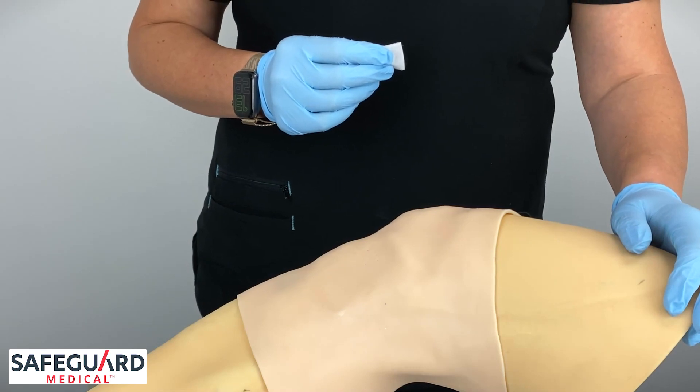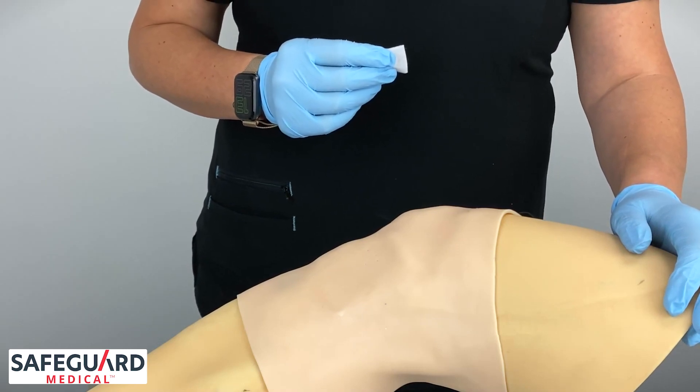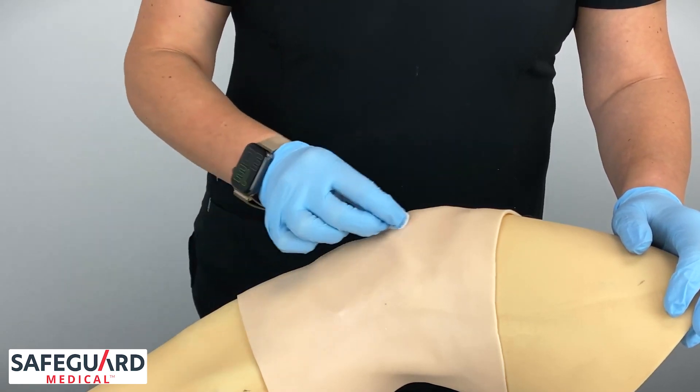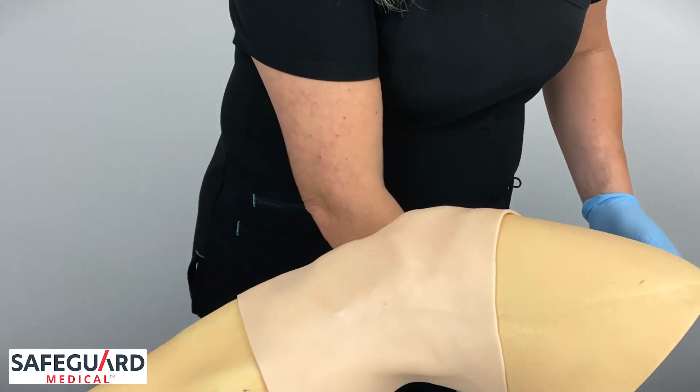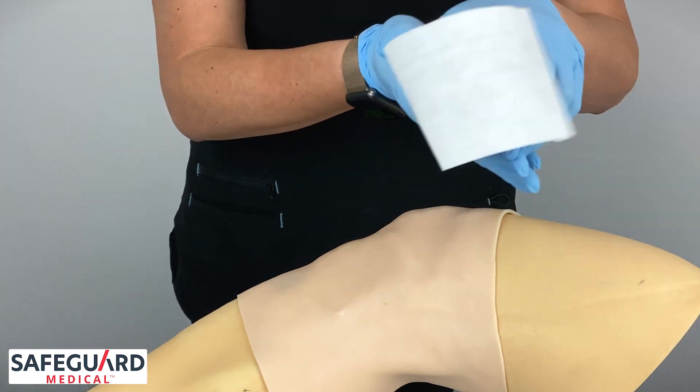Once you have successfully located the insertion site of the proximal tibia, clean per institutional protocol. Remove the sterile BIG from the blister pack.